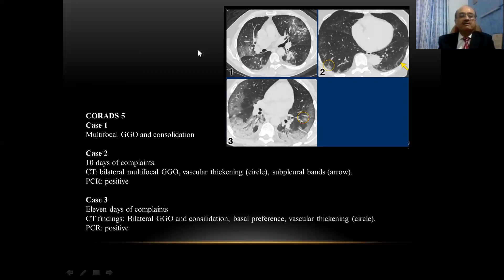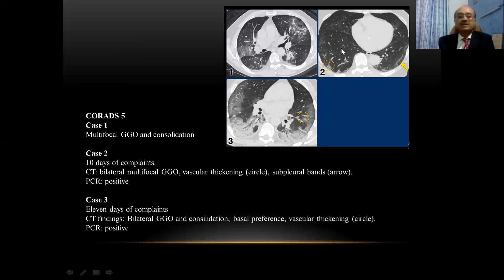CORADS 5 is very highly suspicious of COVID-19. The first case shows multifocal ground glass opacities and consolidation. The second scan, done on the tenth day of complaints, shows bilateral multifocal ground glass opacities with vascular thickening — a very classical finding of COVID-19 infection. It also has associated subpleural bands. Diffuse patchy ground glass opacities, vascular thickening, and subpleural bands combined with a positive PCR give a confirmed diagnosis of COVID-19.